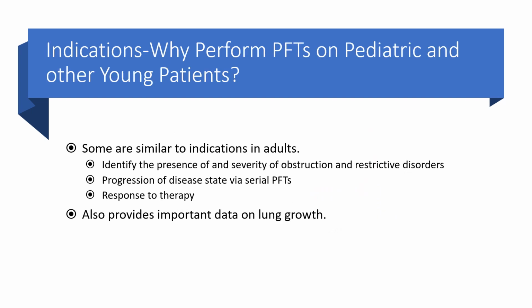So when considering a procedure, it is very important to understand the primary indications, why we're performing that procedure. In this case, why we're performing pulmonary function testing on a pediatric or other young patient. So the major considerations are actually fairly similar to those indications in adults. We're looking to identify the presence and severity of obstructive and restrictive disorders.